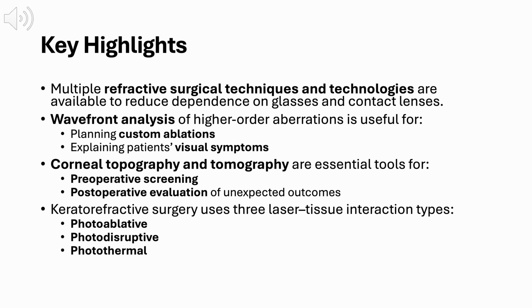by simple refraction alone. Corneal topography and tomography are equally central. They are critical for preoperative screening, particularly to identify corneas at risk, and they become indispensable postoperatively when outcomes are unexpected and require careful analysis. Finally, all keratorefractive procedures rely on fundamental laser-tissue interactions. These interactions fall into three categories: photoablative, photodisruptive, and photothermal, and understanding these mechanisms sets the stage for how different refractive platforms achieve their intended effect on the cornea.